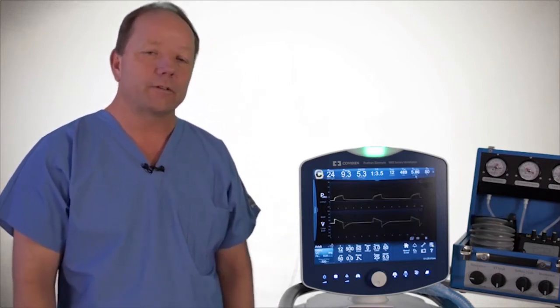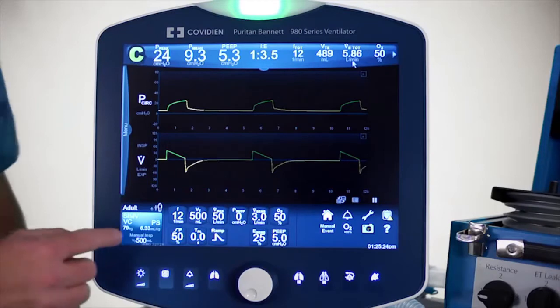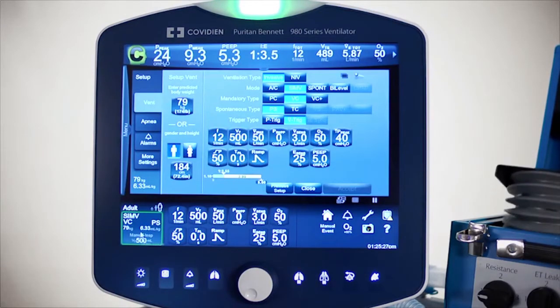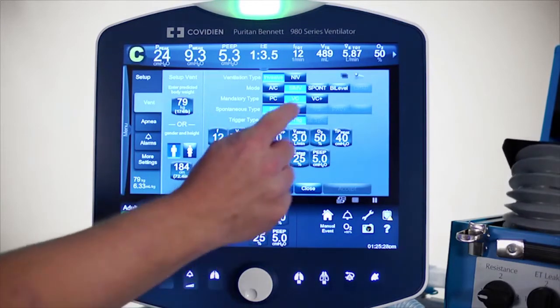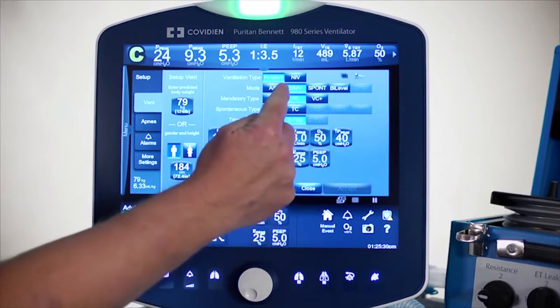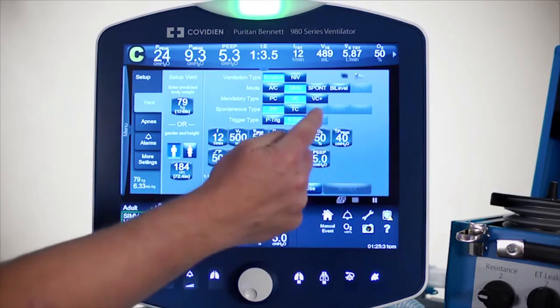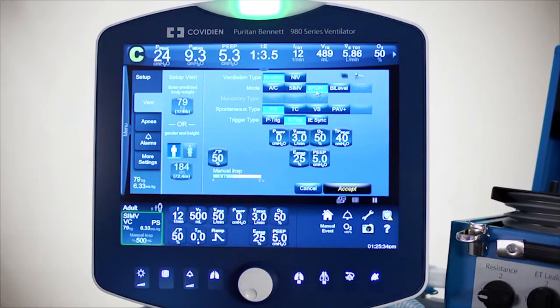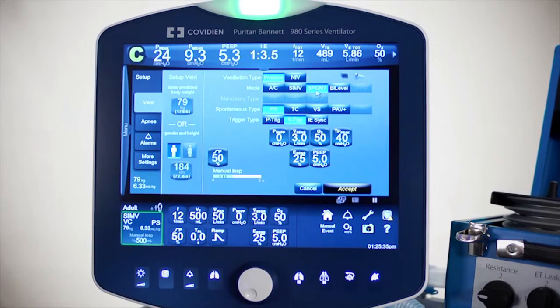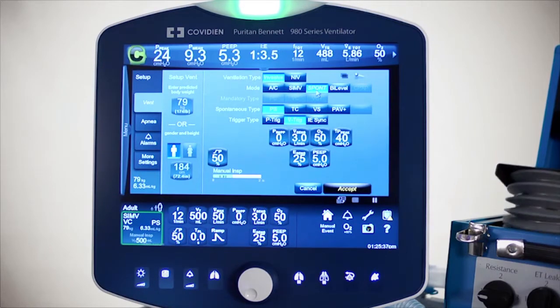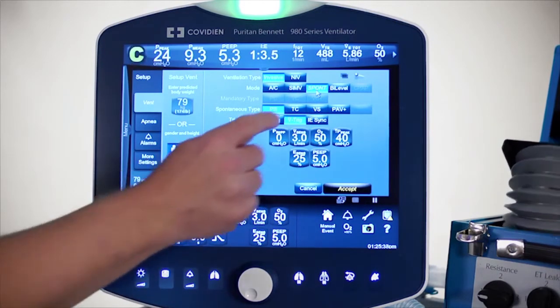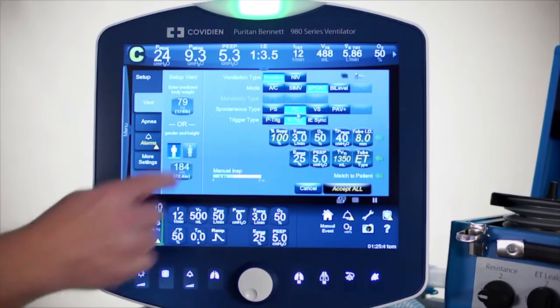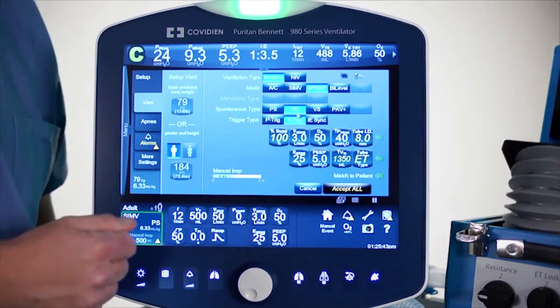So let's look at setting that up. I'll go under the vent setup mode first, then under spontaneous — it does work under SIMV or spontaneous. It is an invasive spontaneous breath type as well. And then I'm going to touch right there on TC, and you'll see the primary variables that it pulls up.